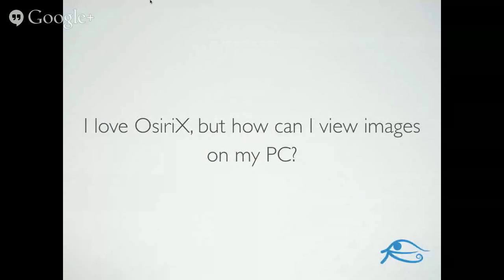So one of the challenges that we certainly have with OsiriX is bringing it into new practices that use PCs everywhere, right? You've got all of these PCs you've already invested in, and you want to use OsiriX maybe in a few locations for diagnostic review of images. So you've got a couple of key workstations with big screens that you use for diagnostic review of data, but you might want to be able to review patient data on a computer in an exam room, for example, to share with a patient or to quickly look at it to size up a fracture. And putting Macs in every exam room may not be entirely feasible for you.